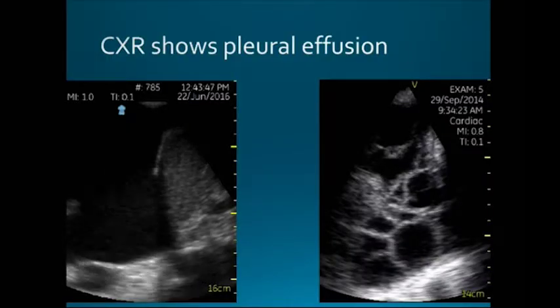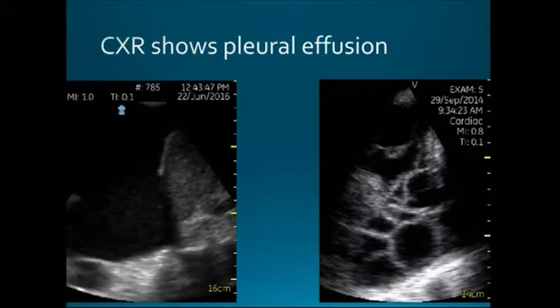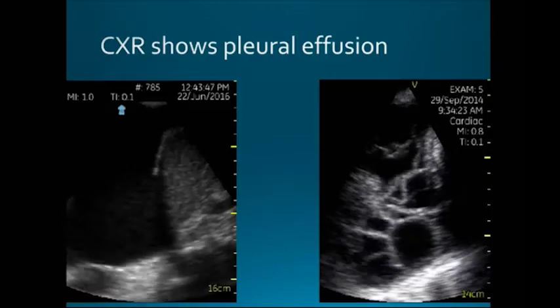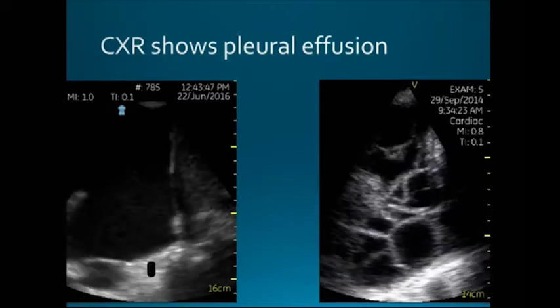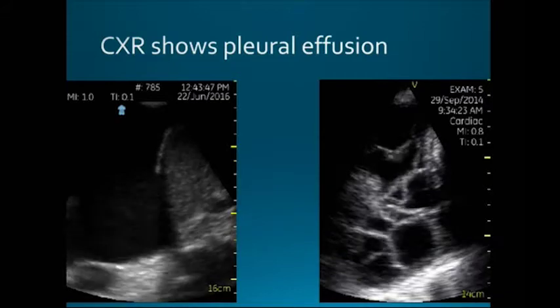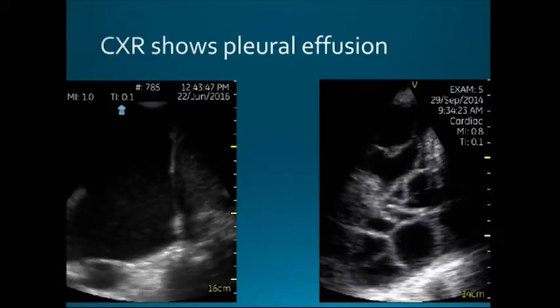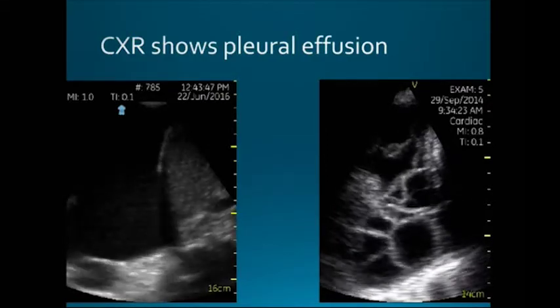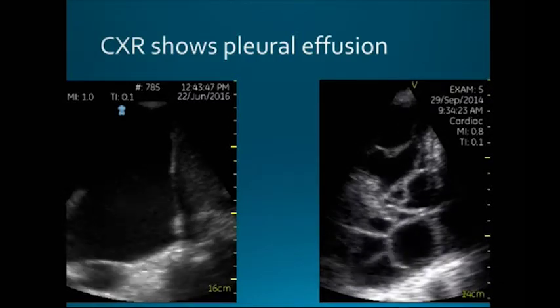The same sort of thing applies with chest ultrasound. This is a view with somebody holding the probe across the body, up around here, using the liver and the diaphragm as our window, and moving the probe around. You can see this is all chest on this half of the screen here, and this is abdomen, and this right here is diaphragm, and you can see a little bit of lung wiggling around in the fluid. And you can see this large pocket of fluid in the chest is a great place to do a thoracentesis, and usually that's how it goes.